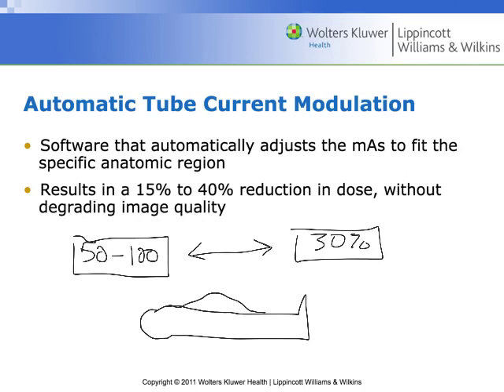Because when it does this initial scanogram, like this scout image, if it sees car keys in there and it sees that area of whiteness on the scan, it's going to automatically crank up its dose. It knows, okay, there's something there that I need to see through. Maybe it's a hip replacement. The machine is just looking at levels of white and black on this image, but it's going to say, I need to crank up the juice there, right?